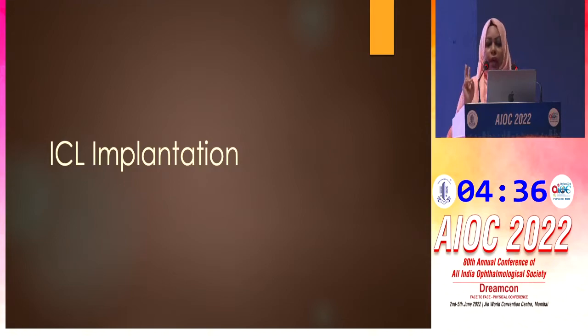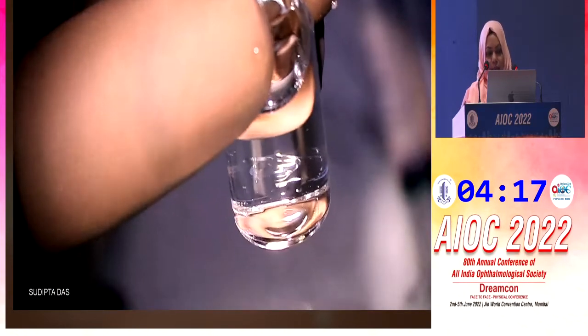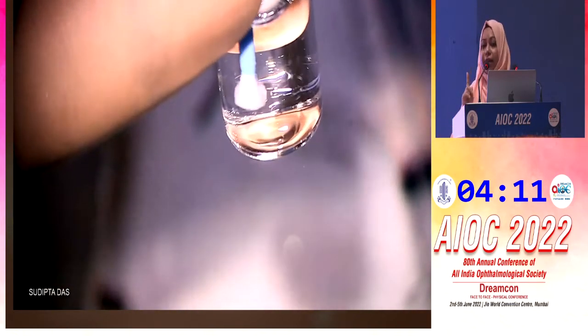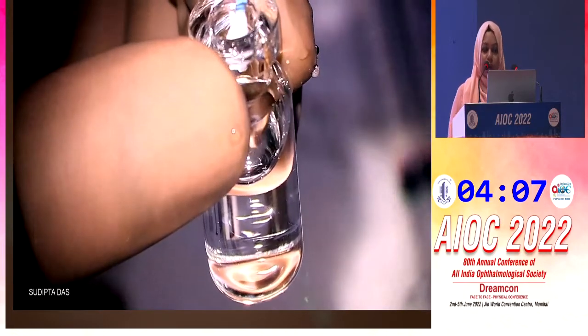In the surgery, I'll emphasize two things. At first, when we are starting, please have someone who has done it before with you, or have the company people there. Why? Because the loading is a bit different. At first, we fill the cartridge with two things, the BSS and the viscoelastic. And this is the bottle for the ICL. This is a very, very soft, thin lens, and there is no second one. So we have to be very careful not to damage it.